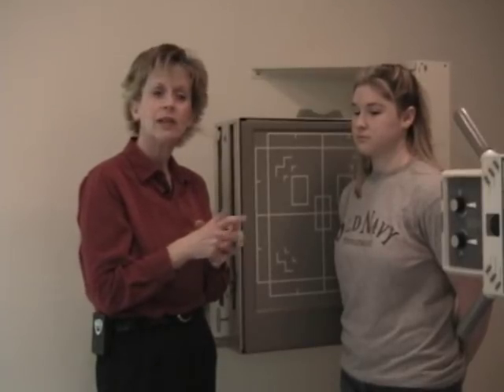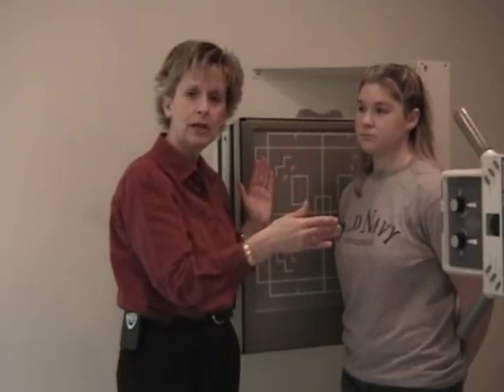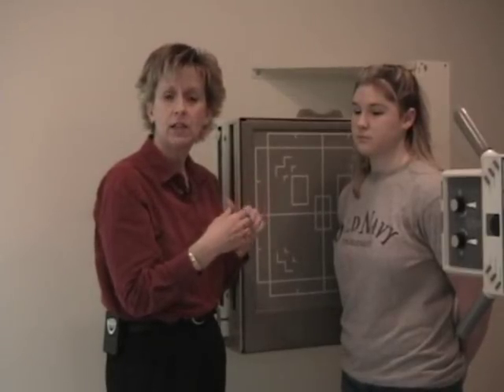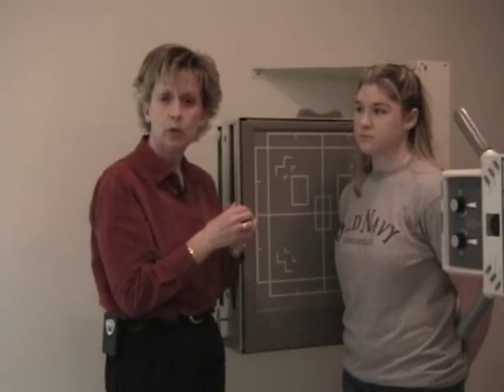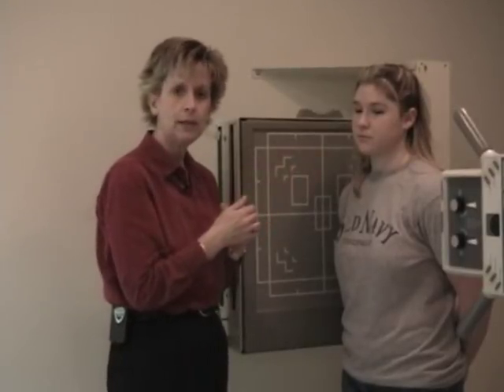But some techs will actually bring the SID in from a standard 40 to a 36 or maybe even a 30. We don't actually promote that because the skin dose of the patient will increase, but it does very definitely have a good effect on magnifying the posterior ribs, and in magnifying anything, you will blur those images out. So that's why some techs do choose to change the SID to a shorter SID.